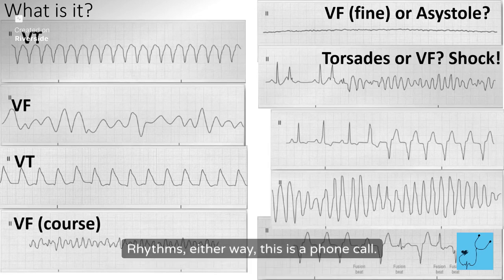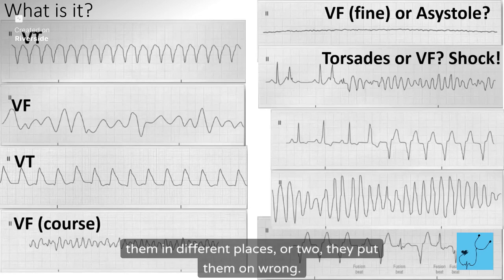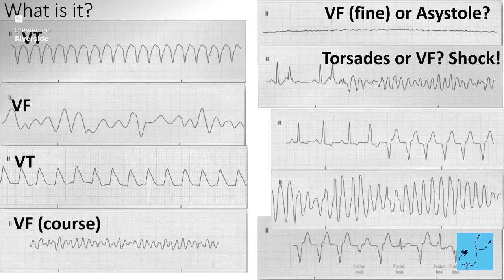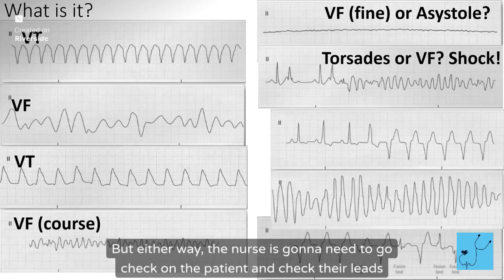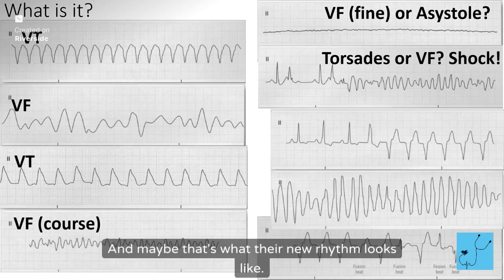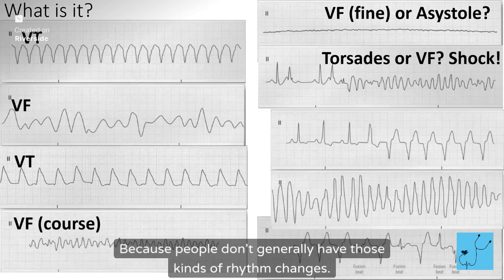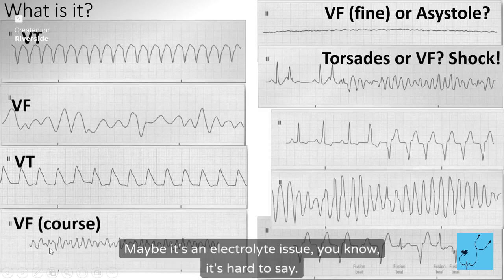Either way, this is a phone call. Now, it could be something as simple as they changed the patches, one, and they put them in different places, or two, they put them on wrong. But either way, the nurse is going to need to go check on the patient and check their leads and make sure everything is accurate. And maybe that's what their new rhythm looks like. And the nurse needs to decide, is this something I need to call on or not? Because people don't generally have those kinds of rhythm changes. Maybe it's an electrolyte issue, it's hard to say.